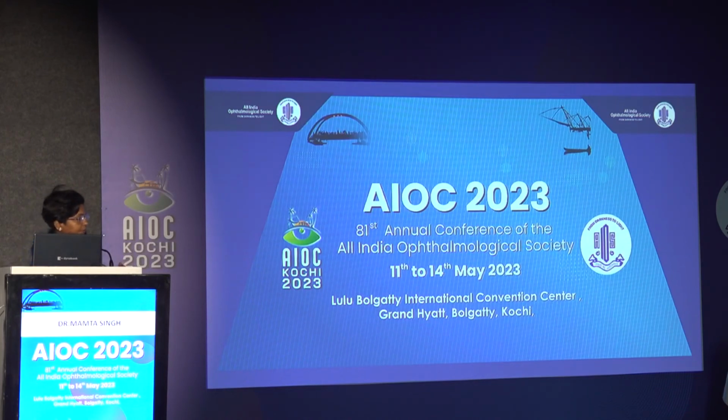That is for sure. And these topographers usually come with other modalities for evaluation of the anterior surface, like tear film and other things. Is that going to add to the information, or is it just of mathematical value? No, definitely anything which gives information about the surface is going to be useful. Because we all know that dry eye, in addition to any of the allergic disorders, is going to be an added hazard over the ocular surface.